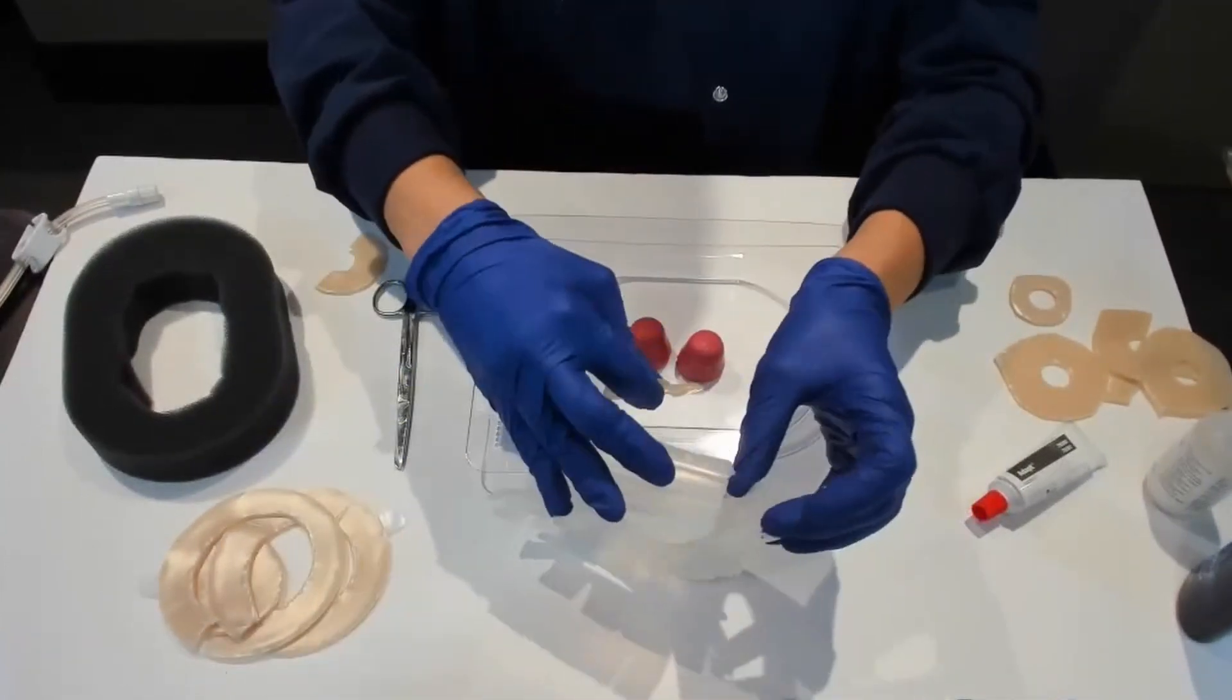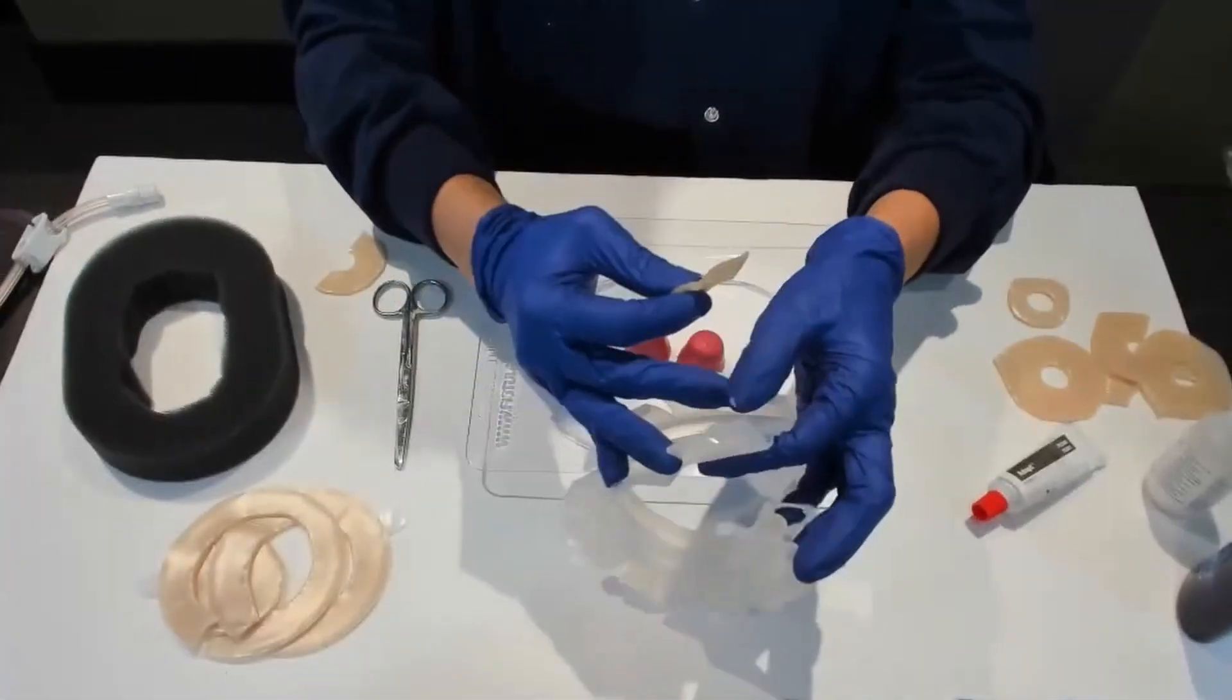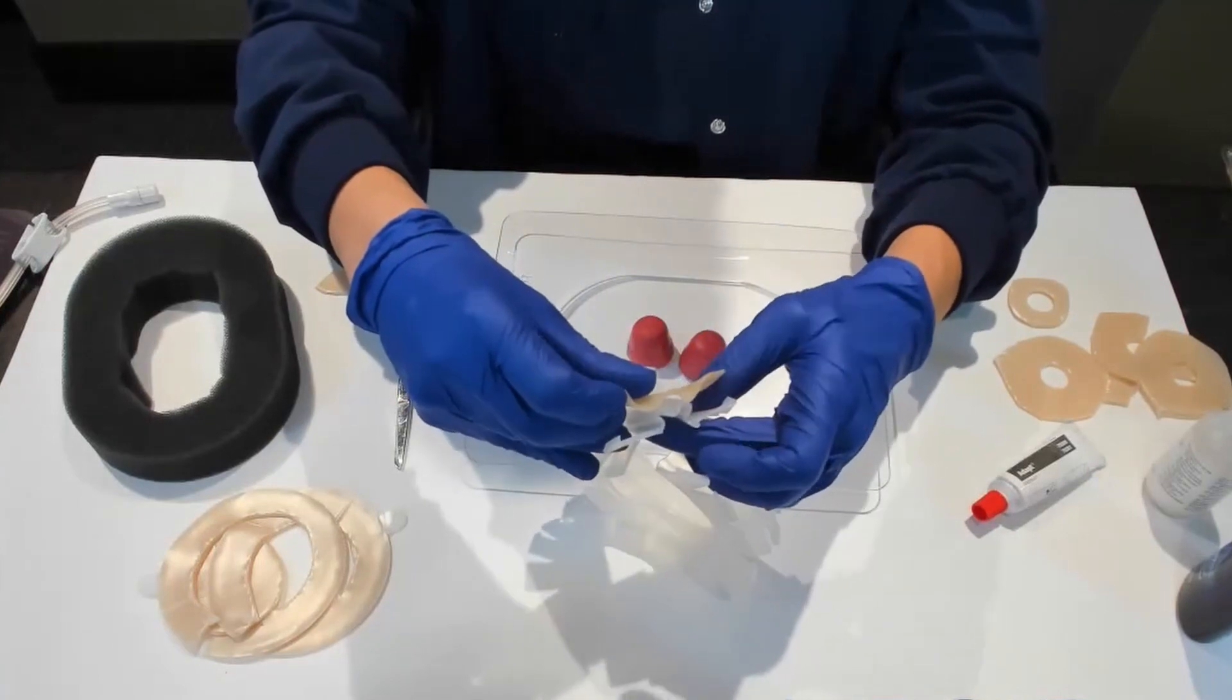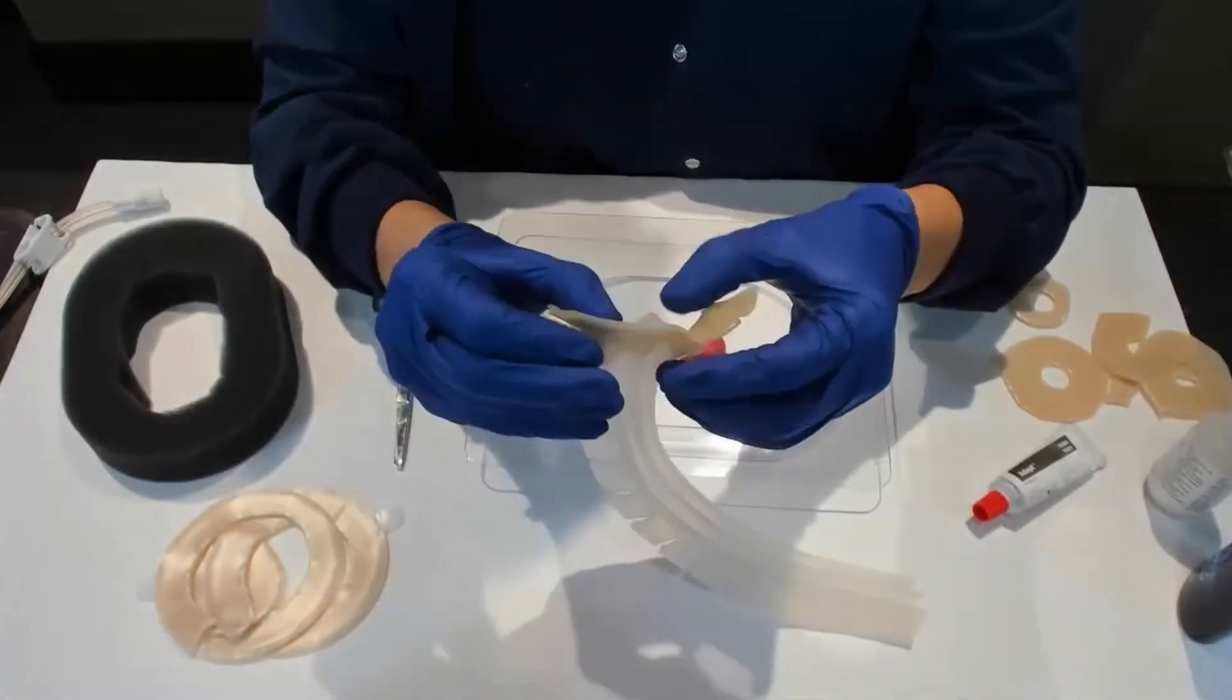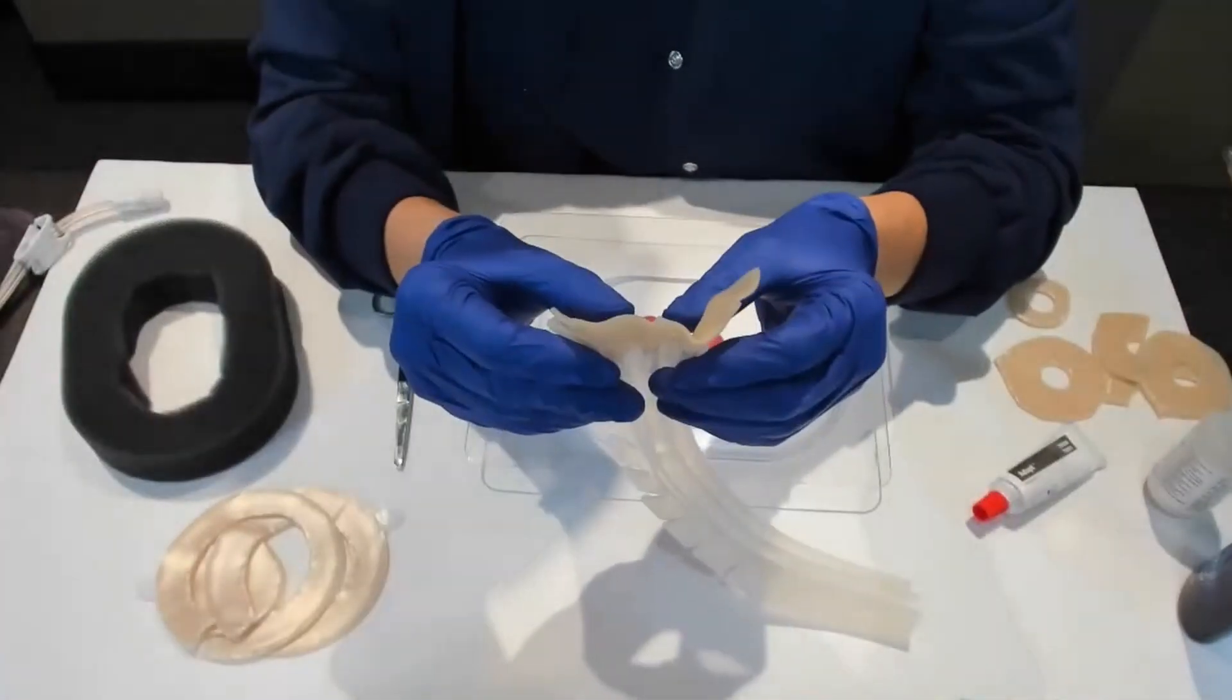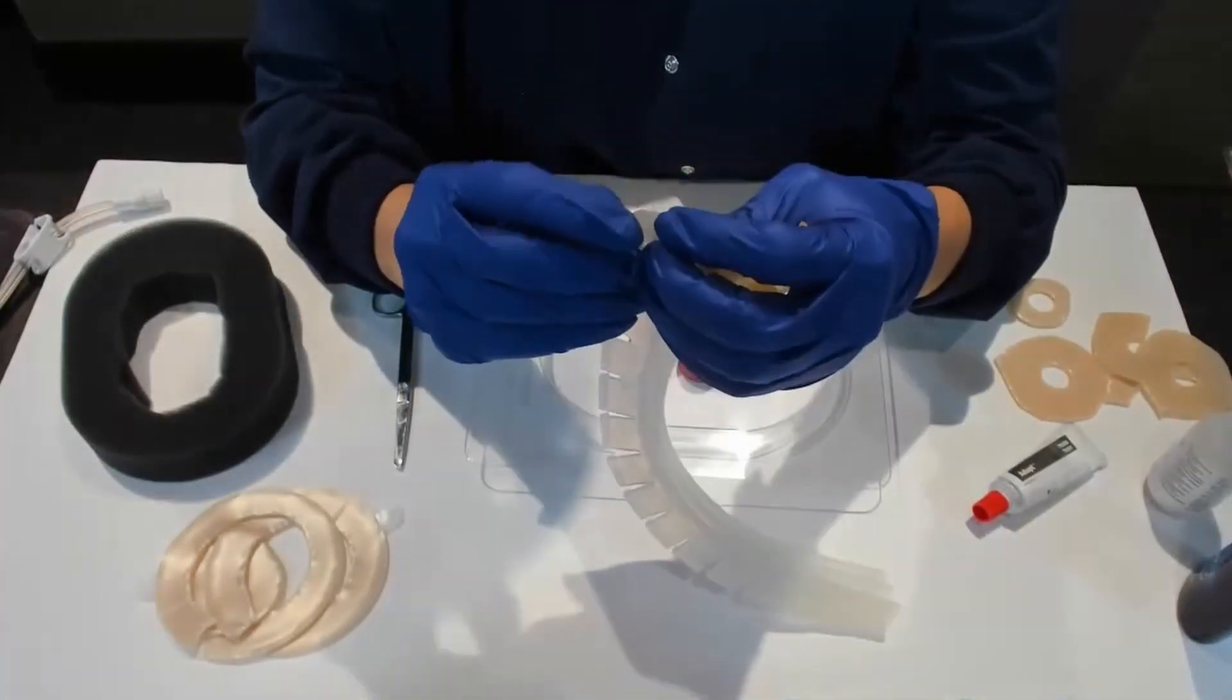You're going to want to take some of this sticky stuff. Where it marries itself up again, you want to make sure you have hydrocolloid across that juncture. Then you really want it to marry itself up.